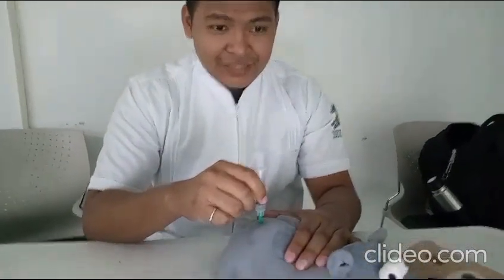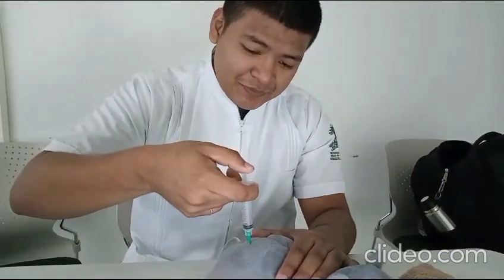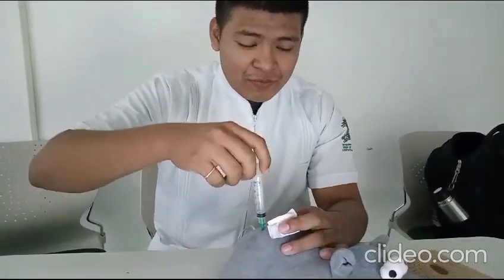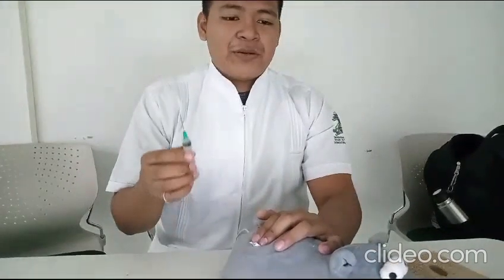You must aspirate the syringe and verify that no blood flows, and proceed to slowly introduce the medicine. Finally, remove the needle and place a cotton swab, applying slight pressure for at least 1 minute. Remember to give the necessary recommendations to the patient.